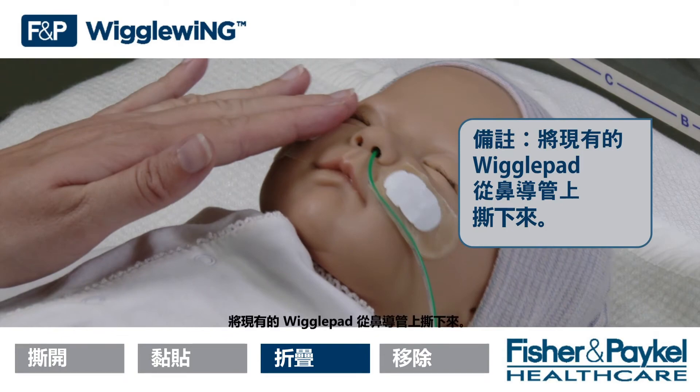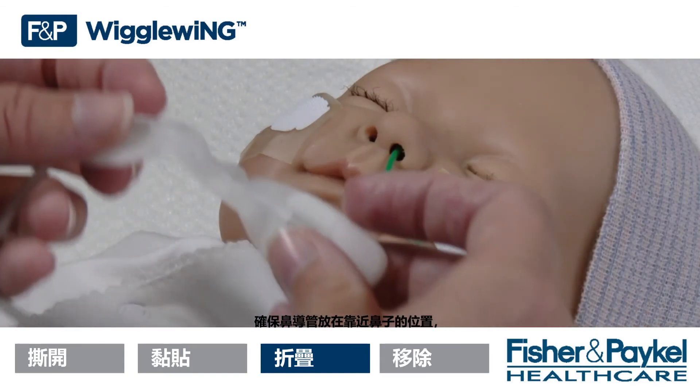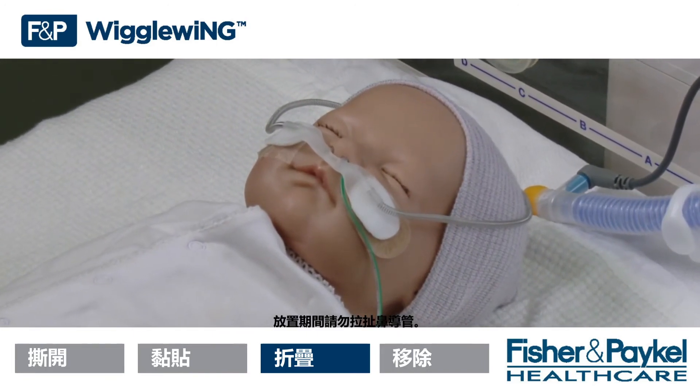Note: Remove the existing wiggle pad from the nasal cannula. Secure the cannula in place so the cannula bridge rests close to the nose without touching the septum. Do not stretch the cannula during application.